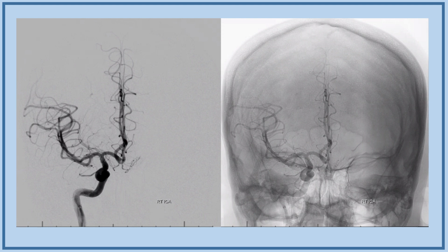So what did we show? Well, for once, I think in all of these things and all of our pipeline experience and the web and these different things coming around, what's a little bit underappreciated is the very slow advances in maturation of coil technology. All of these things, the imaging that we have here, allow us to really appreciate and understand what this aneurysm is, and the coils. The reality is that the challenging aneurysms are these. The tiny ones are the ones that are hard.